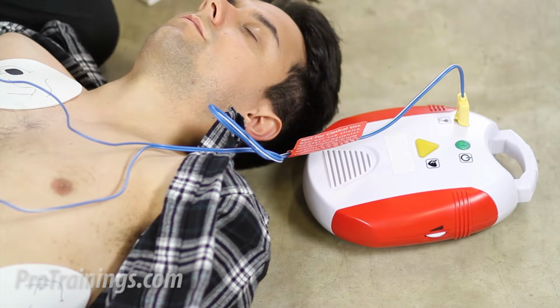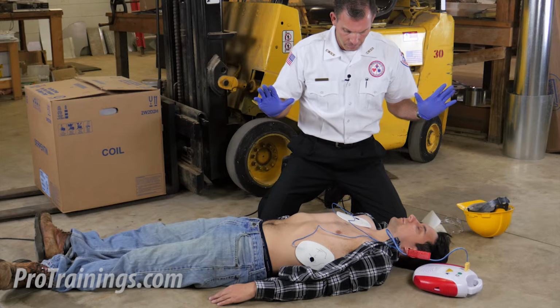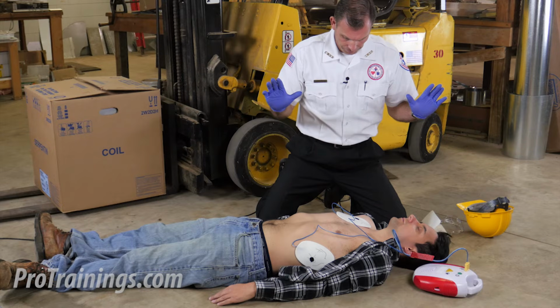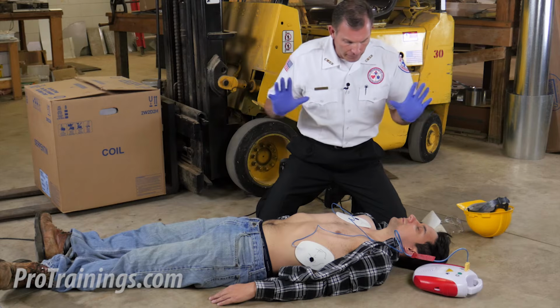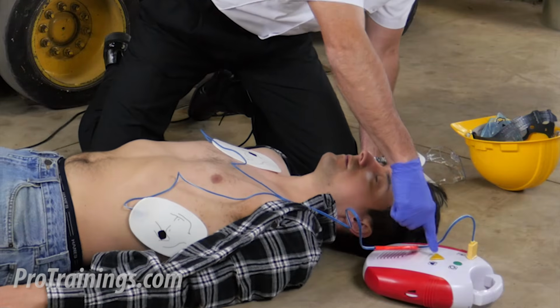Analyzing rhythm. Everyone stand clear. Not touching the patient. Shock advised. Charging. Everyone stand clear. Check to make sure no one's touching the patient. Everybody's clear. Everyone stand clear. Push the shock button. Shock delivered.